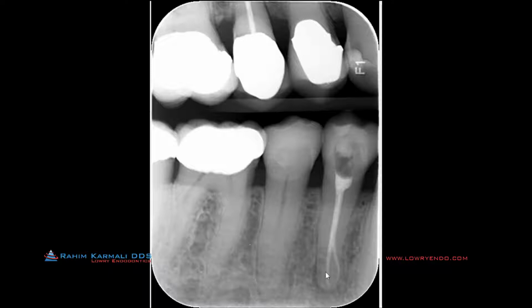The first is it looks like the root canal treatment has been well done. The anatomy is complex. There's a deep apical split here, which was very well managed. And when I see a well-done root canal treatment failing, I'm concerned as to whether I can fix it or improve it at all. The second thing that concerns me is this lucent area in the chamber.